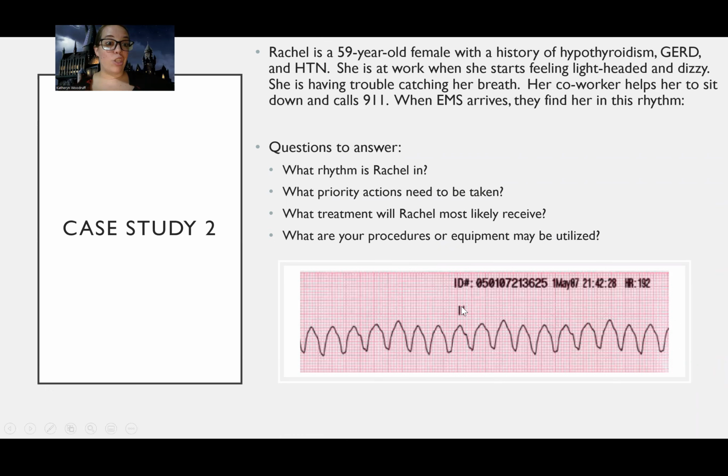So let's do our systematic methods. Let's count. 1, 2, 3, 4, 5, 6, 7, 8, 10, 11, 12, 13, 14, 15, 16, 17, 18. A lot of students ask, would we count the ones that are kind of half? And generally, as long as part of them is in there, I do count them usually.